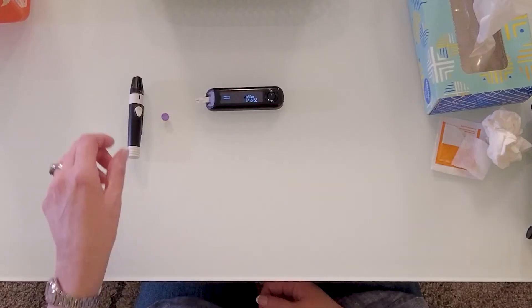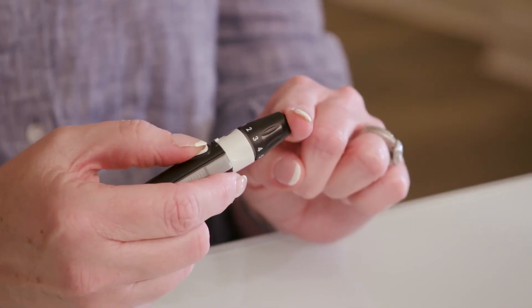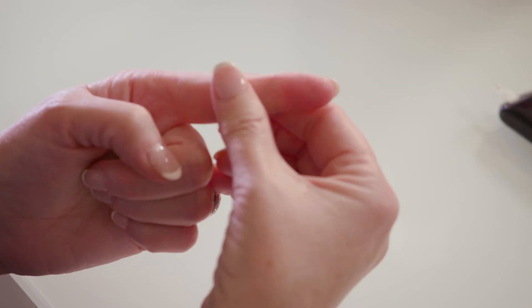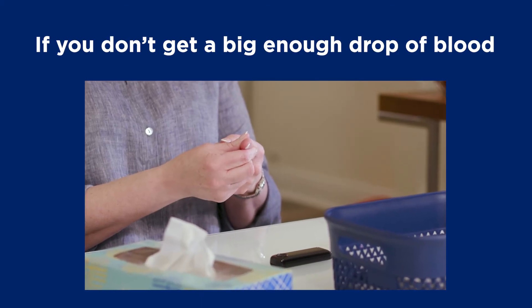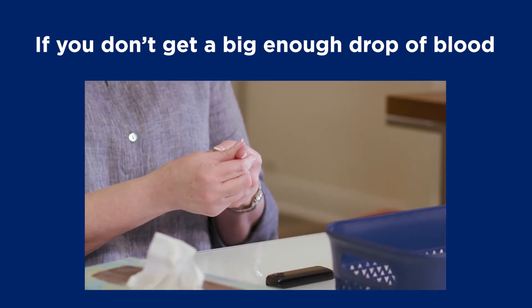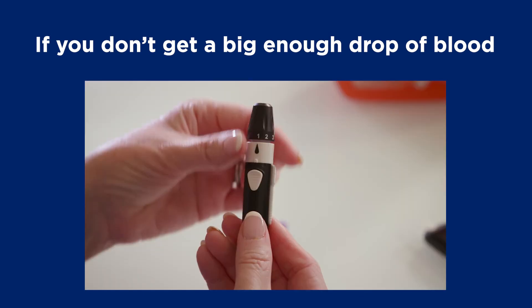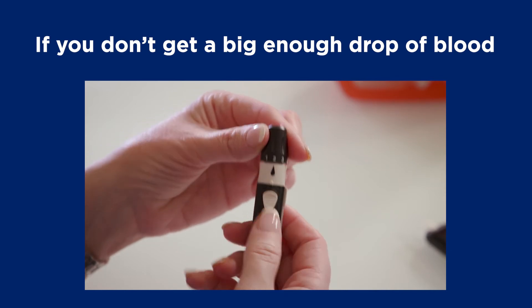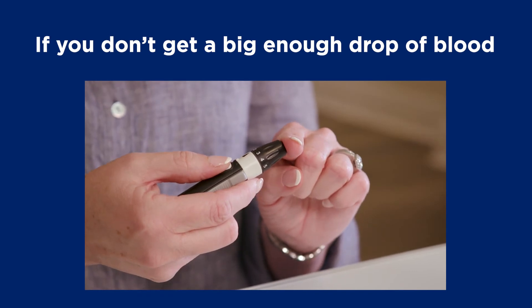After you've cleaned and dried your finger, hold the lancing device firmly against the side of your finger and press the release button. Move the lancing device away from your finger right away and look for a drop of blood. You may need to gently massage or squeeze your finger, but don't do this too hard or your results may not be accurate. If you don't get a big enough drop of blood, you'll need to prick your finger again. Reset the lancing device, turn the dial to increase the puncture depth by one level, then set it firmly against your finger and push the release button again. It's okay to use the same lancet.